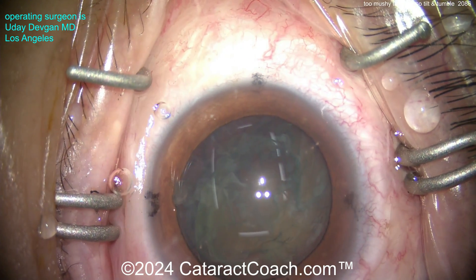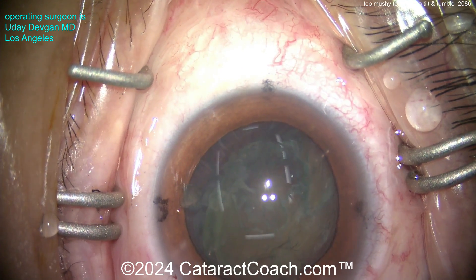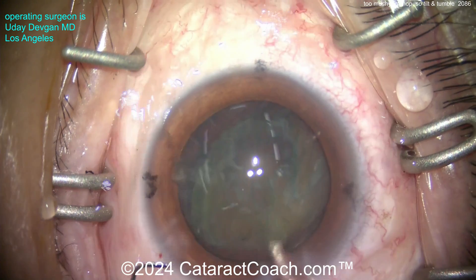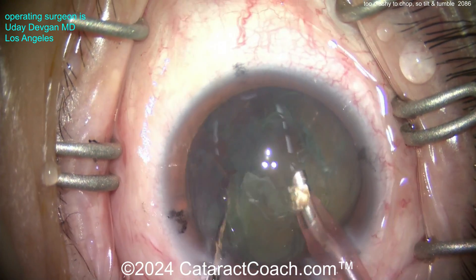Looks like we're pausing here for a moment - maybe there was a code on the machine that needed to be reset. But this technique was popularized by Dick Lindstrom. Dr. Lindstrom described this many years ago. It's a very efficient technique, especially for a higher volume cataract surgeon, especially in a population that doesn't have too many absolutely dense cataracts.